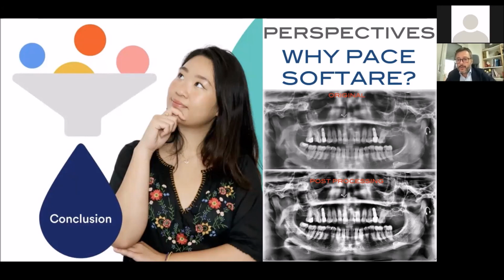As future work, quantitative evaluation of the improvement made to the images by areas of interest can be performed. In addition, this software can be used as a pre-processing step for other applications for automatic detection of pathologies affecting bones, cysts, tumors, or resorption and caries of teeth.